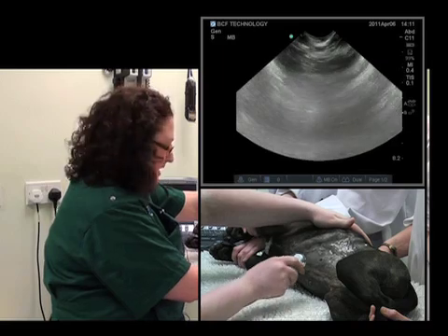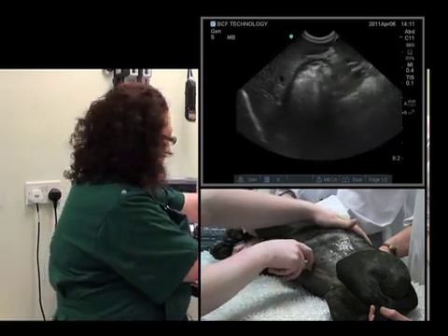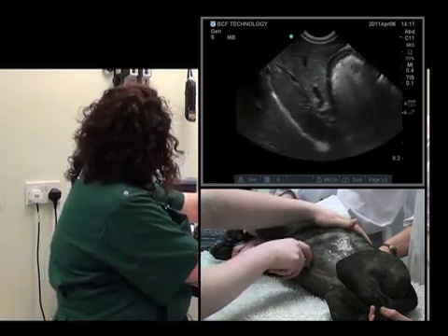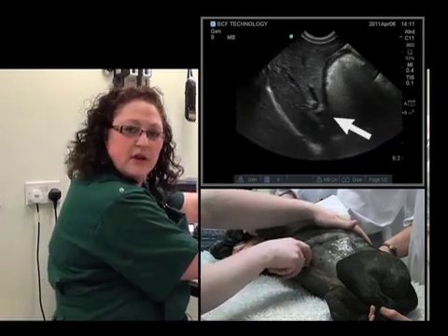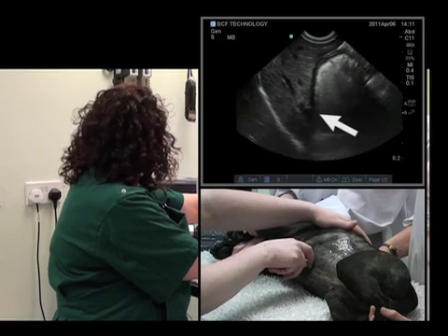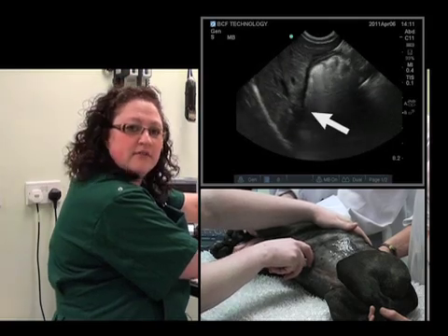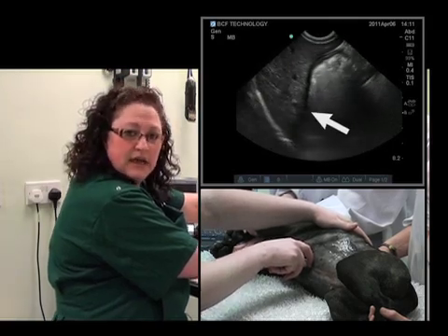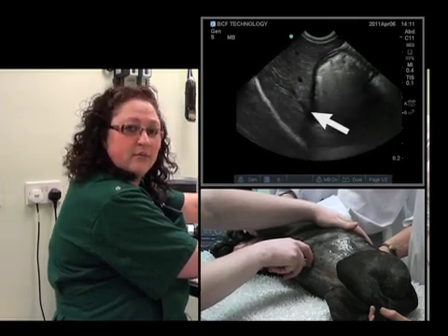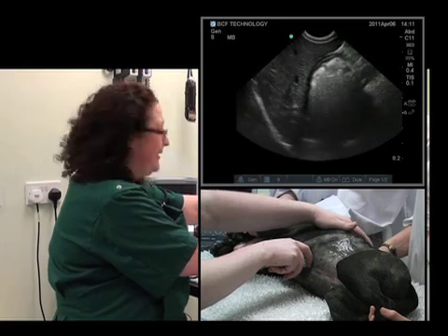We'll go in the sagittal plane at the level of the xiphoid sternum, and the liver comes into view. We'll want to assess depth, gain, and time gain compensation for assessing the stomach.